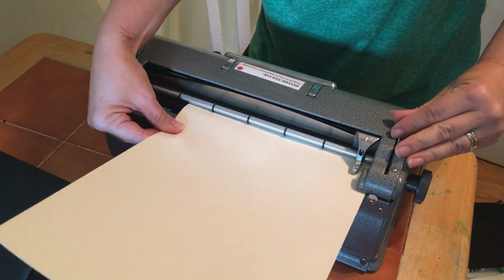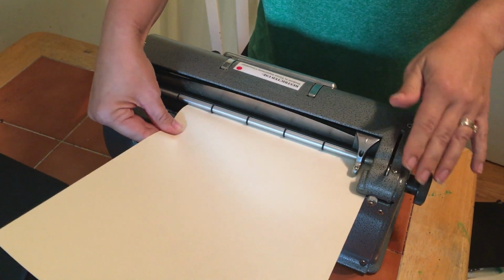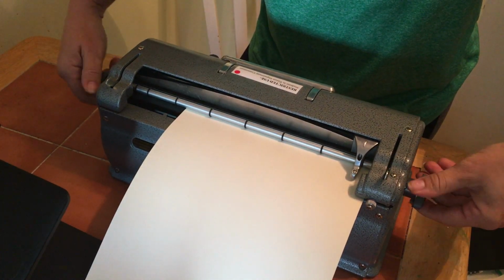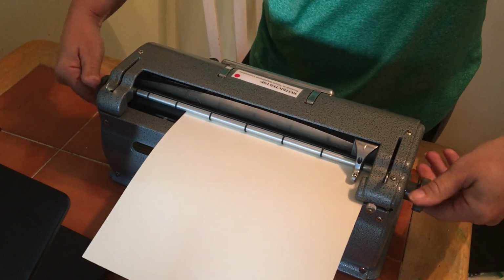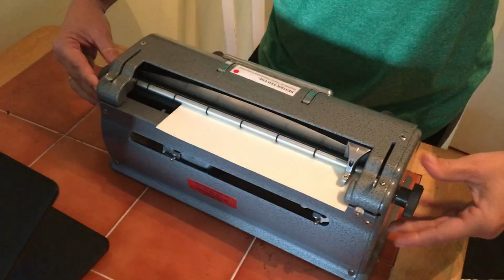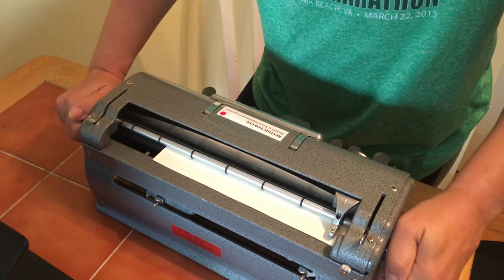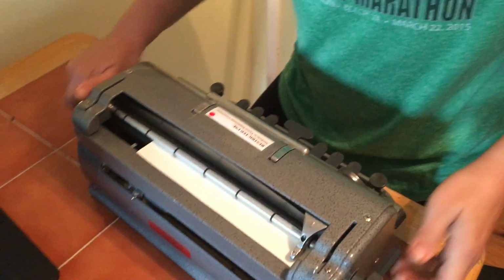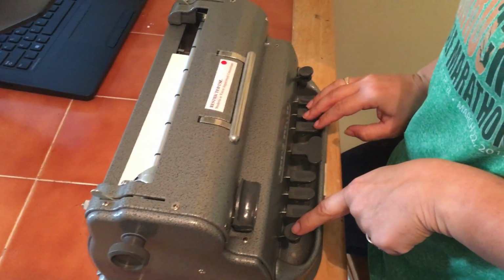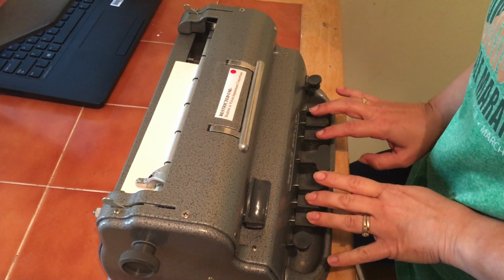And then once it's where we want it to be and secure, we're going to lock it in by pushing the release levers back. And then we should be able to pull this to turn these rollers all the way towards us to load the Brailler and get our embossing head to the top of the paper. It stops on its own. So then once that's stopped, we're going to go to the next line by pushing the line advance button once. And then we are ready to start brailing.